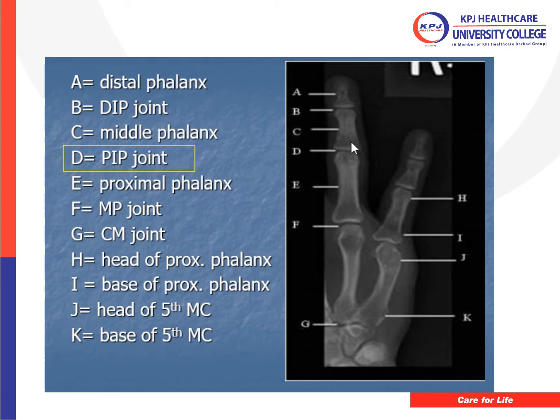So for fingers, we can see later what is supposed to be included when you are projecting the phalanges the correct way. So here we can see this fourth and fifth fingers radiograph, PA of fingers.